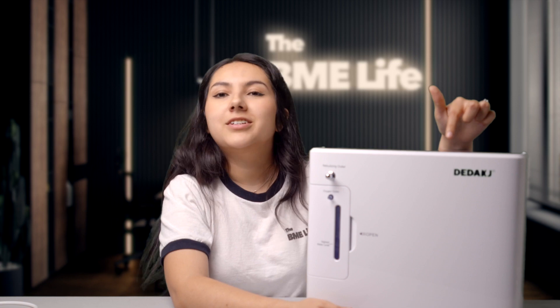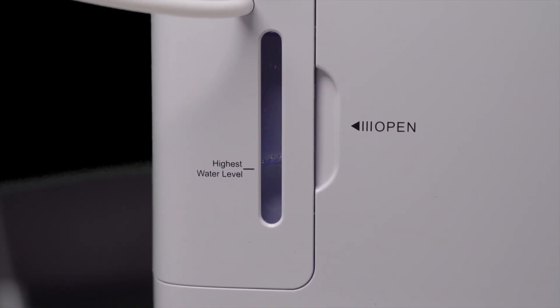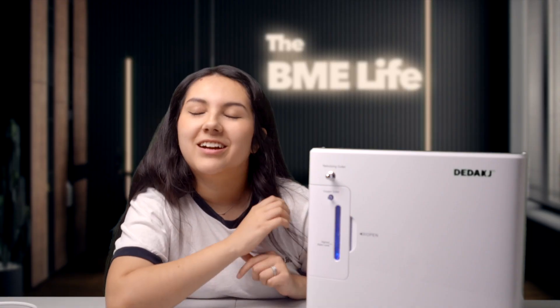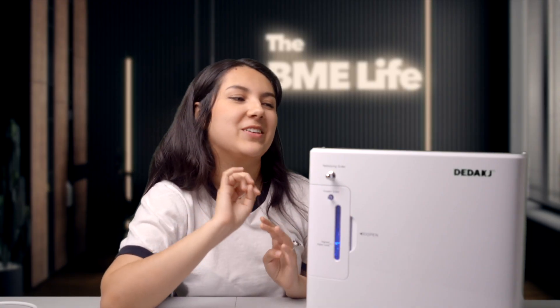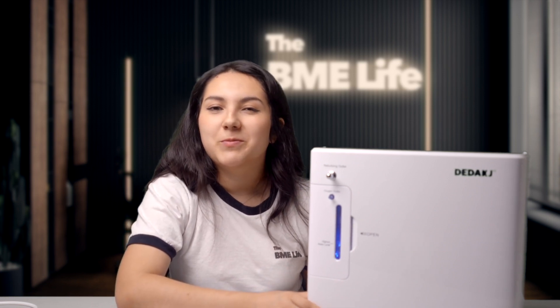Then up here on the touch screen, you simply press on and it'll start working. It has a really cool blue light that I think is very relaxing, and honestly I kind of like the sound and the bubbles that it makes. Some people might find it annoying, but I think it sounds pretty relaxing.